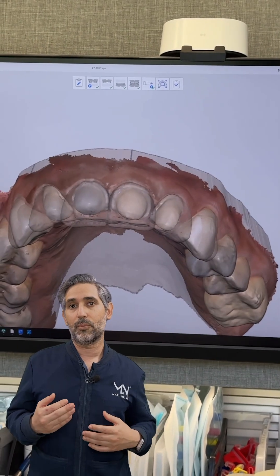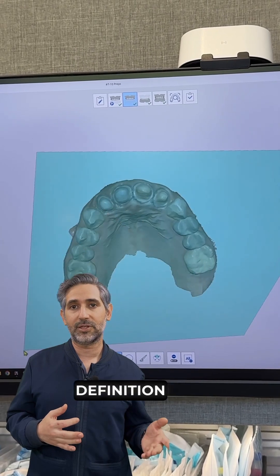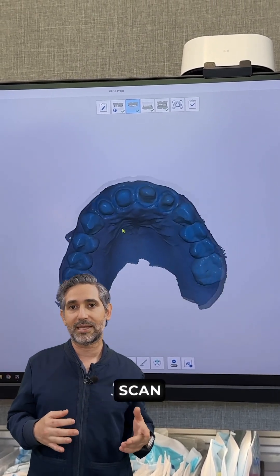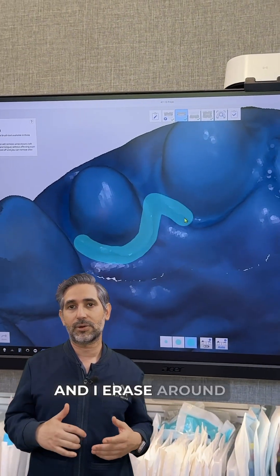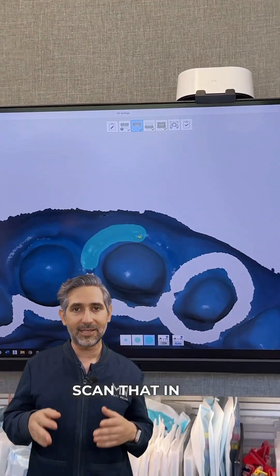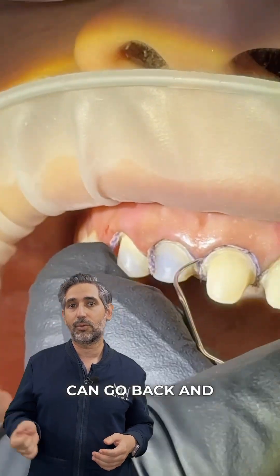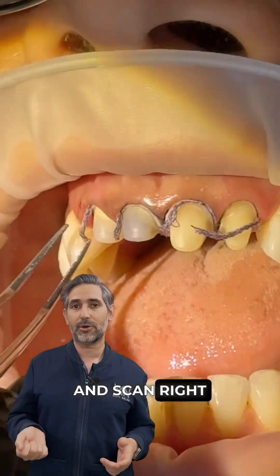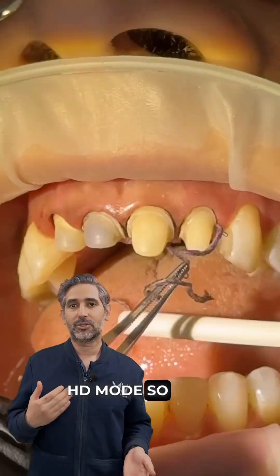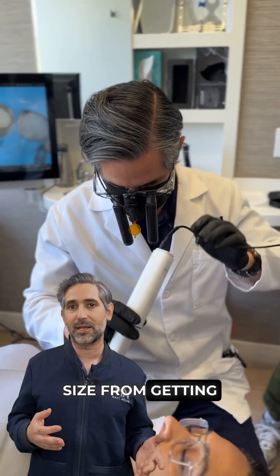Once I'm happy with that, I go ahead and do my scan in regular definition. Then I lock that scan and I erase around all the different margins so that I can go back and scan that in HD mode. I pack the cord and then I can remove the cord and scan right over this in HD mode so that I get the most definition around the margins, but keep the file size from getting too large.